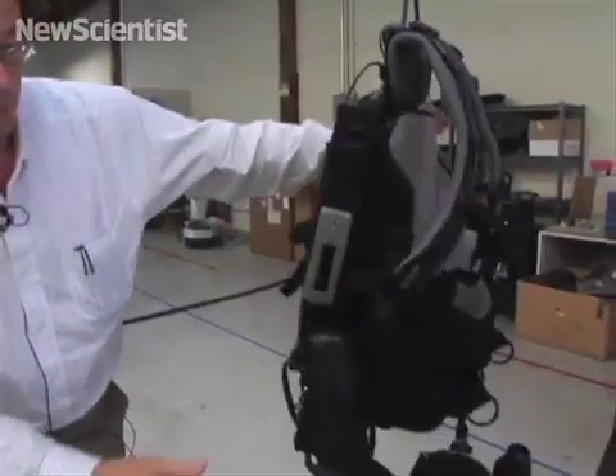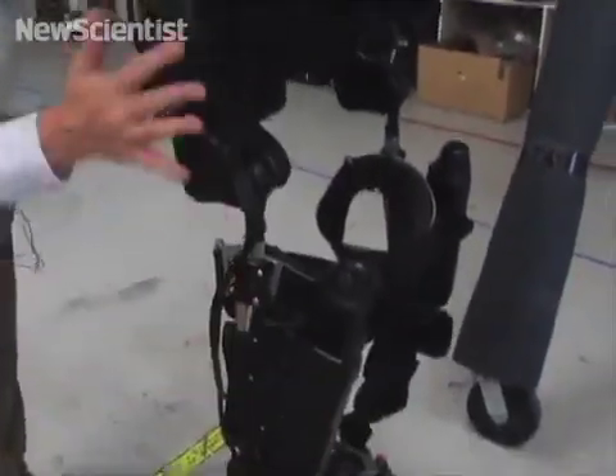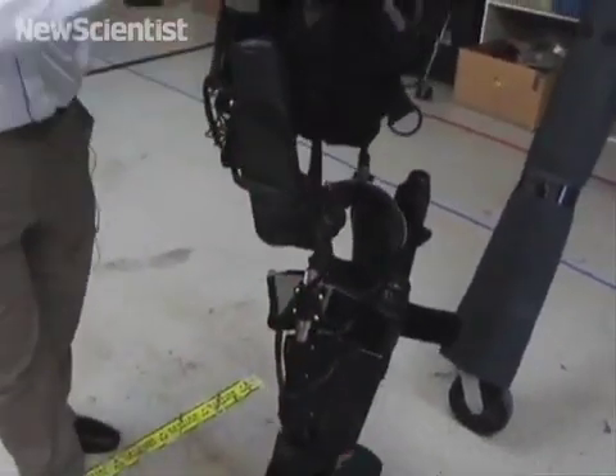We have our actuated hips, our actuated knees here and here, and of course we have the sensors that come up into the machine.